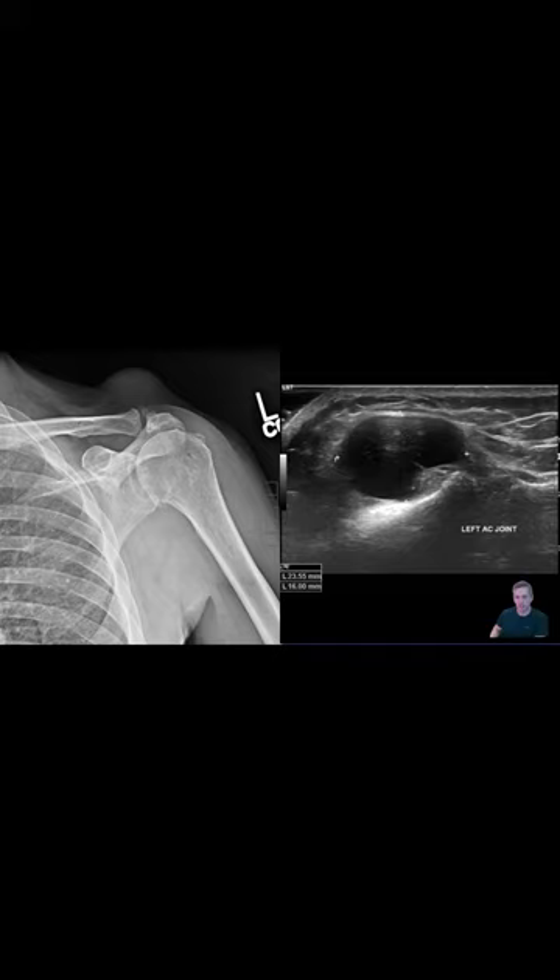There are no significant irregularities in the contour of the wall, no surrounding soft tissue swelling or cobblestoning or anything like that. The mass is actually — I said heterogeneous, but really fairly uniform in appearance.